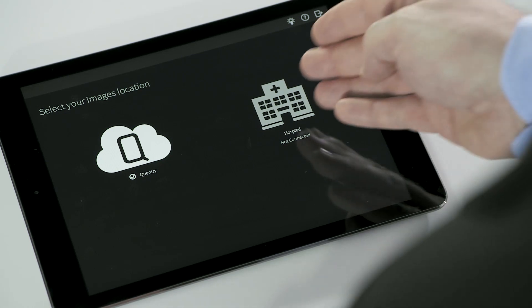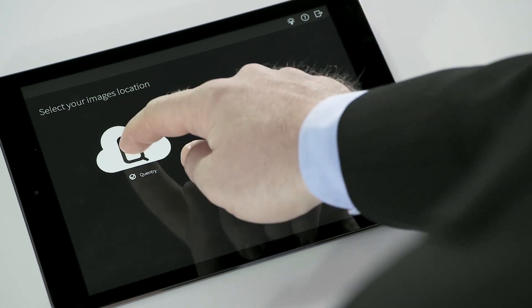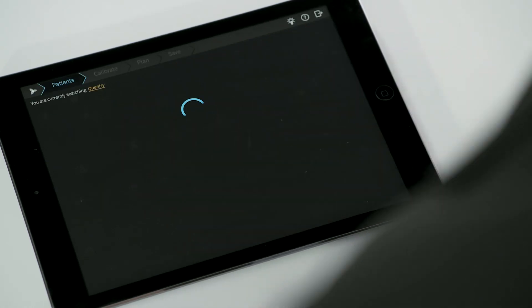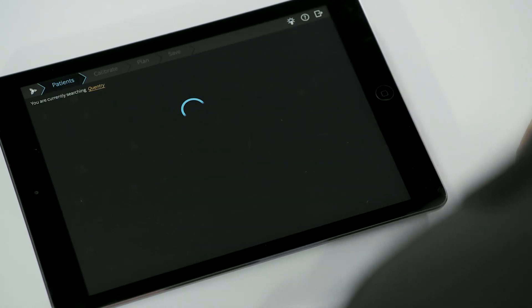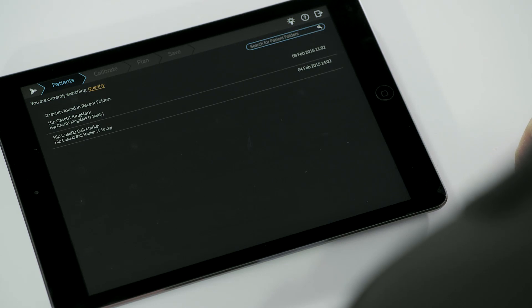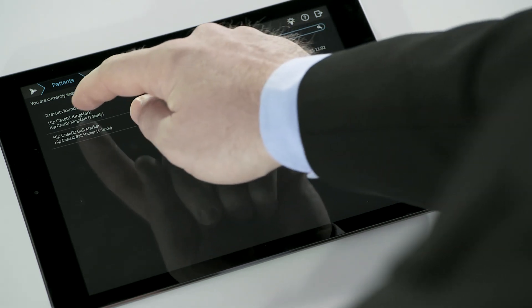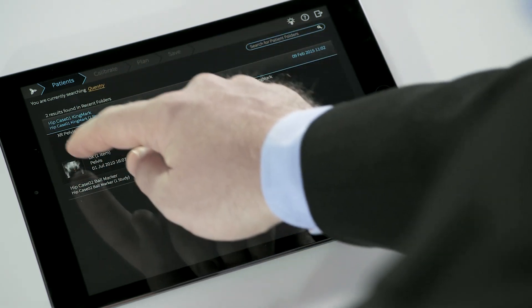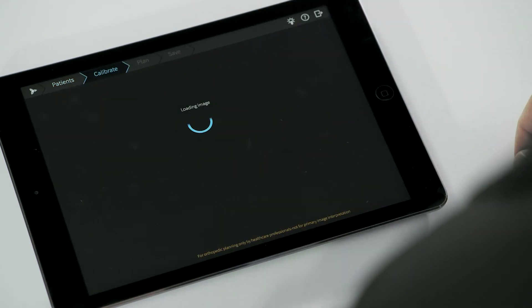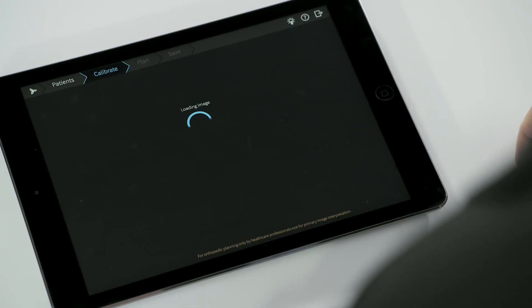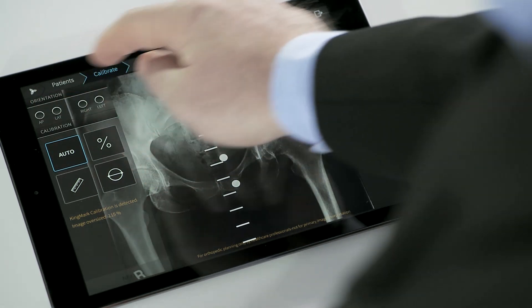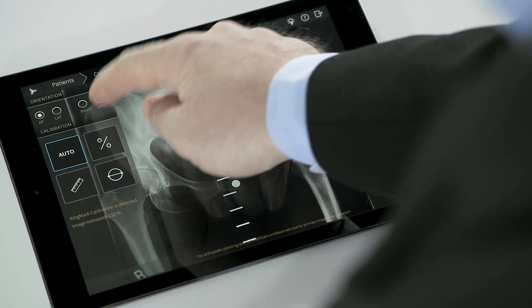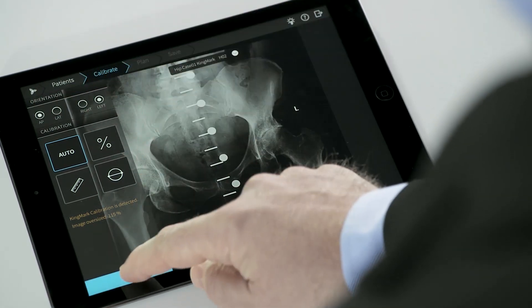Once logged in, select any image from the hospital PACS system or from Quentry, the secure image-sharing platform from BrainLab. After selecting a hip x-ray, the application automatically detects the calibration marker — KingMark in this case — which is specifically designed for AP Pelvis.